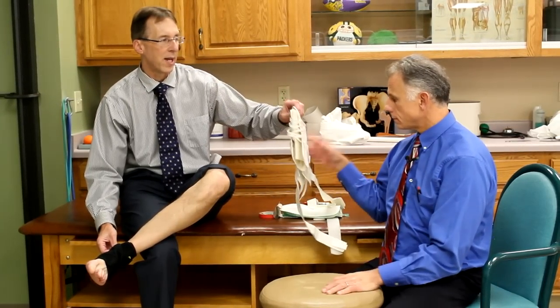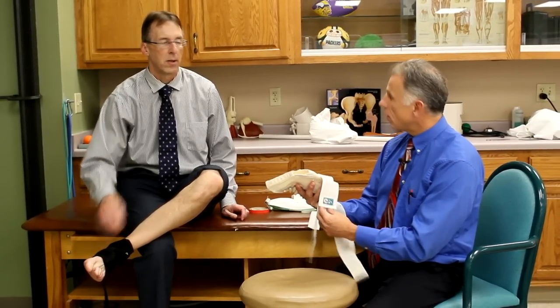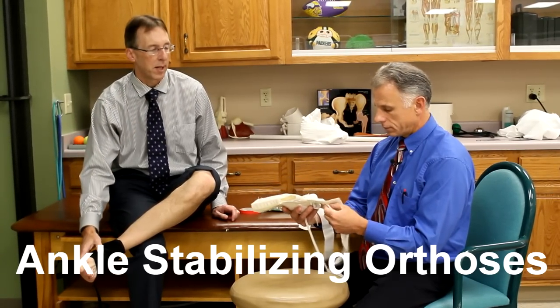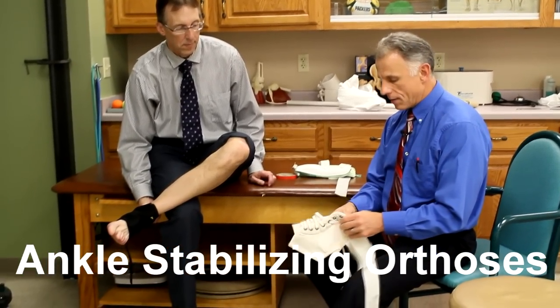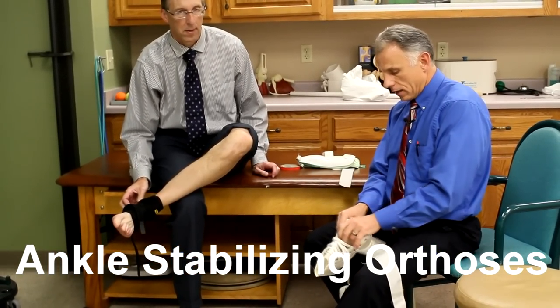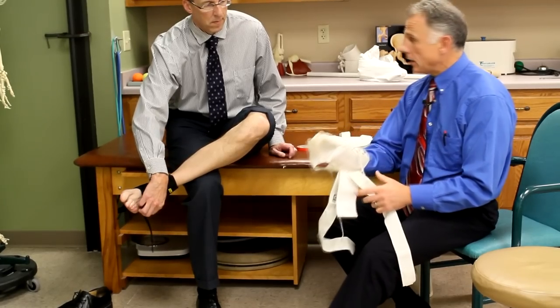This brace will help with proprioception. If you want to go back to sports and you have a grade two sprain — or even a grade one — you're going to use the ASO. I am a big believer in ASO; this is my personal ASO. ASO stands for Ankle Stabilizing Orthosis. They cost more, but they do the job. I was running in a wooded area, sprained my ankle, and wanted to get back to running competitively, so I bought an ASO. It's comfortable for running — no problem at all.